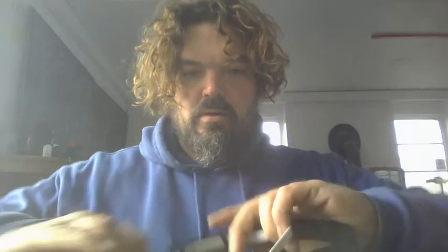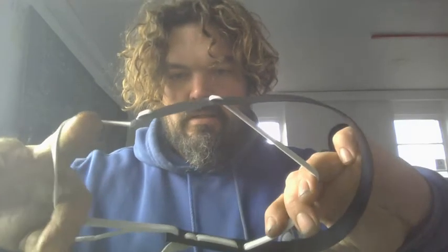So, here you go. This is what it looks like. And then, when I wear it, you know, you see here, I can put two fingers. So, I have a lot of room and I won't get completely stuck with the screen.